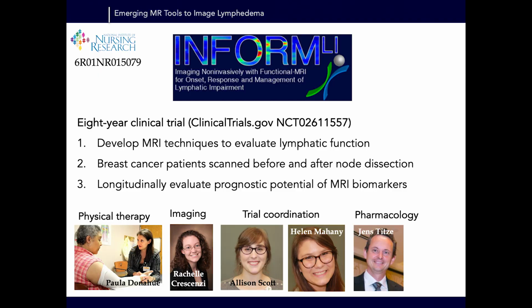So at our center, we're now in the 4th or 5th year of an 8-year clinical trial, which we've called INFORM. This is funded by the National Institute of Nursing Research, and it stands for Imaging Non-Invasively with Functional MRI for Onset, Response, and Management of Lymphatic Impairment. And the idea with this is, first we're developing MRI techniques to evaluate lymphatic function. So we bring in patients that have advanced stage lymphedema, and then we validate the contrast that we're trying to develop in those patients. So we have patients with known deficiencies.